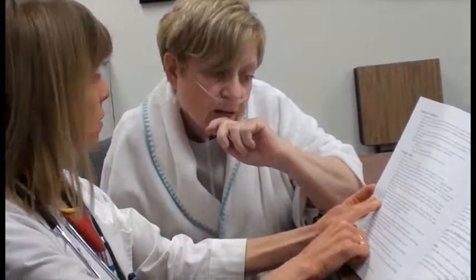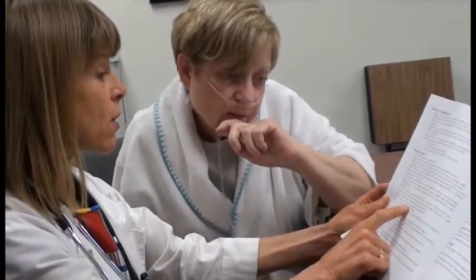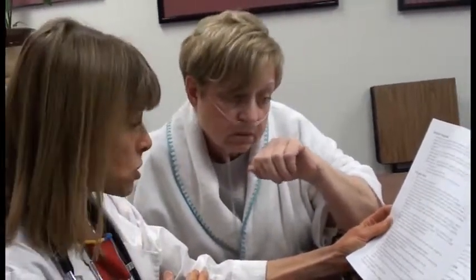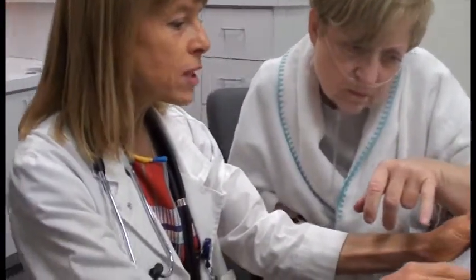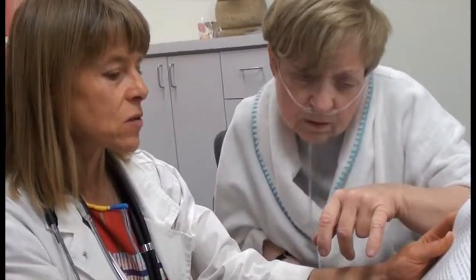And then about your little grandchild, do not change your flow rate without your physician's authorization, or turn it off. So be careful. You're supposed to have a certain amount. I think your order was 2 liters. 2 liters. Yeah, that's what you want to be careful with all the time. And never use it for other things besides medical oxygen. But what else would I use it for, honey? Well, they just don't want you thinking about other ways to use it. Okay? I've got enough going on. Exactly. And then down here it says, watch out around the tubing, don't trip, keep your children and pets away.